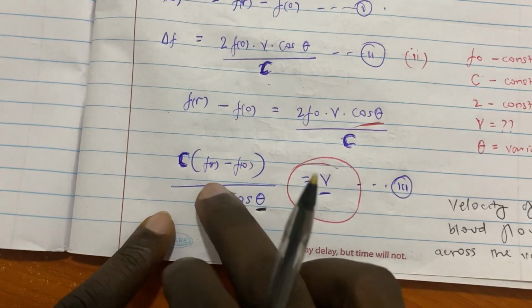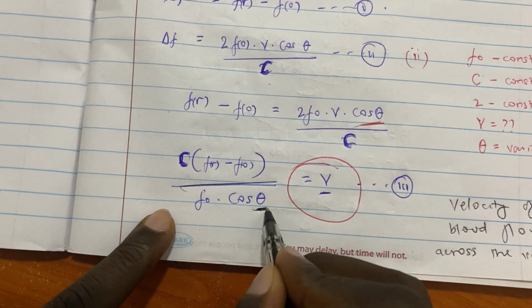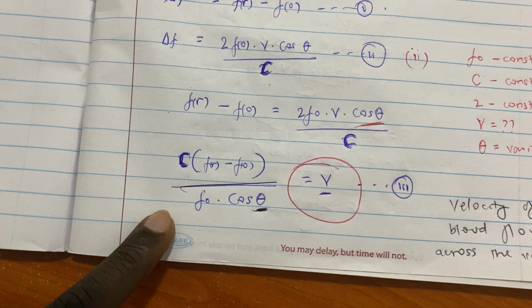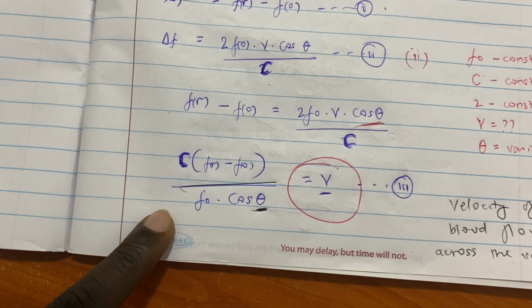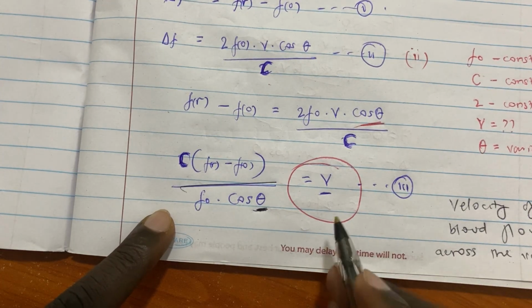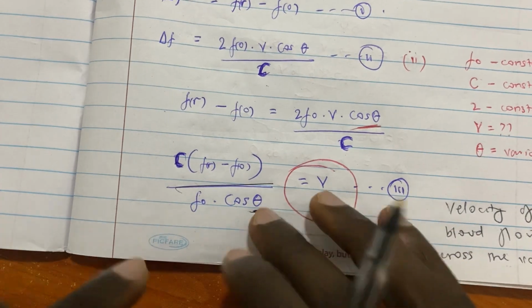I've showed you how we relate velocity with the Doppler shift here. This is how we relate them. The machine will know this. It will depend on you whether you have been as parallel as possible or not. You don't need to do these calculations.